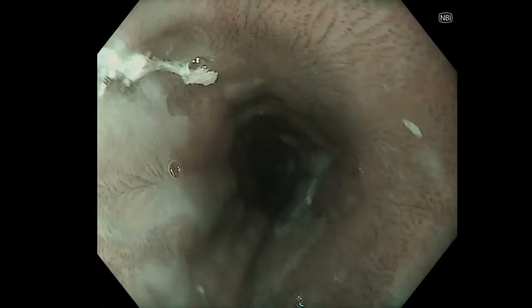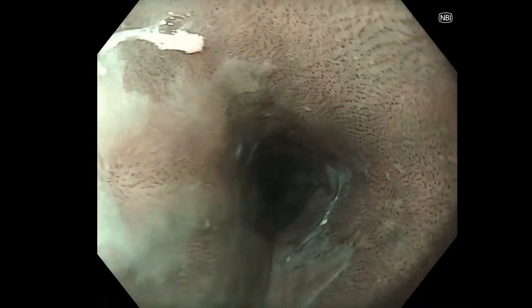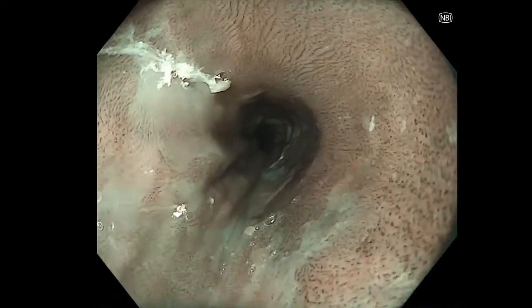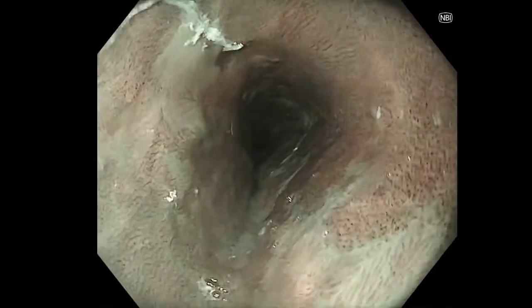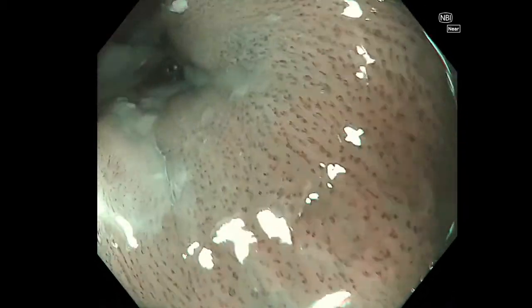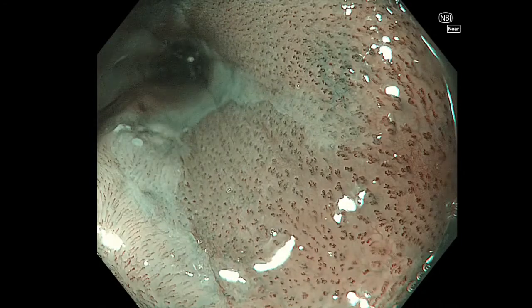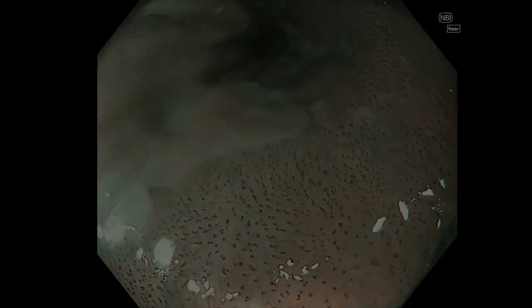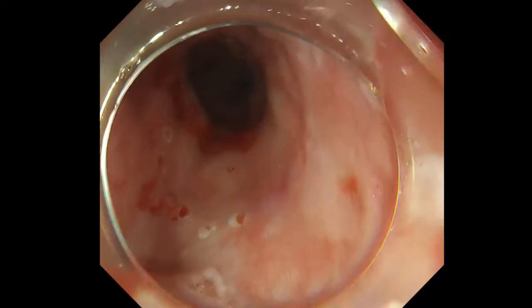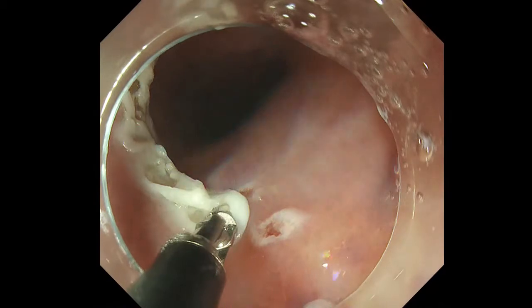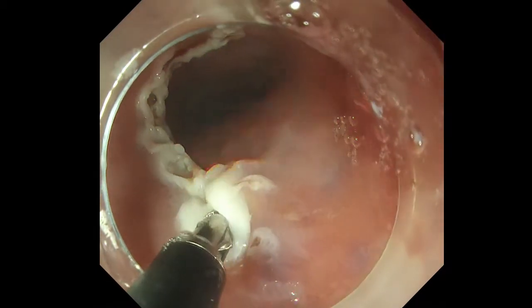This is the esophageal region in case 2, which was histologically diagnosed as a squamous cell carcinoma on biopsy examination. Ablation by hemostatic forceps was performed, because we could not perform endoscopic resection due to severe fibrosis of a scar from previous endoscopic resection.